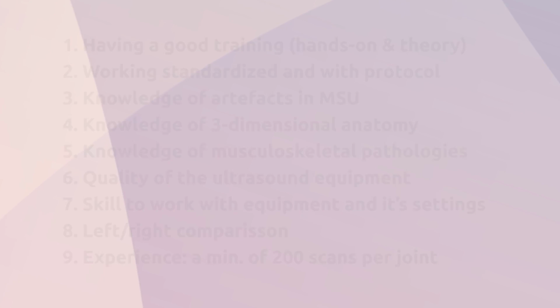The physiotherapist seems one of the professions who are most suitable with their background in musculoskeletal anatomy, pathology, and examination. But only as long as they use MSU a lot, since there is a long learning curve. This long learning curve goes for every profession. It's very important to understand that MSU also has limitations. Therefore, to me, evidence-based physiotherapy is the combination of a good clinical examination and a MSU scan and applying clinimetrics.